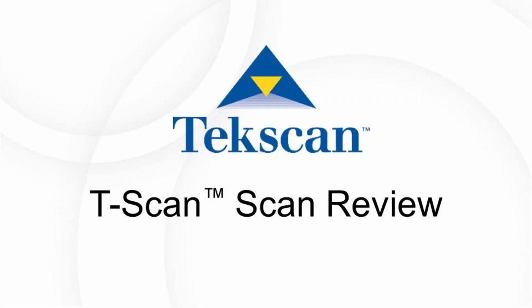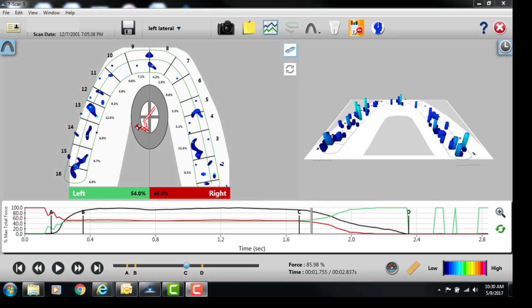Welcome. In this demonstration, I just wanted to review a lateral excursion and the steps on understanding how and where to adjust if we see a scan. With this case, we have a patient that seems to have a decent bite in regards to balance. You can see that the dark blue forces and some lighter blue are sprinkled throughout the arch. This displays that we have some even balance.